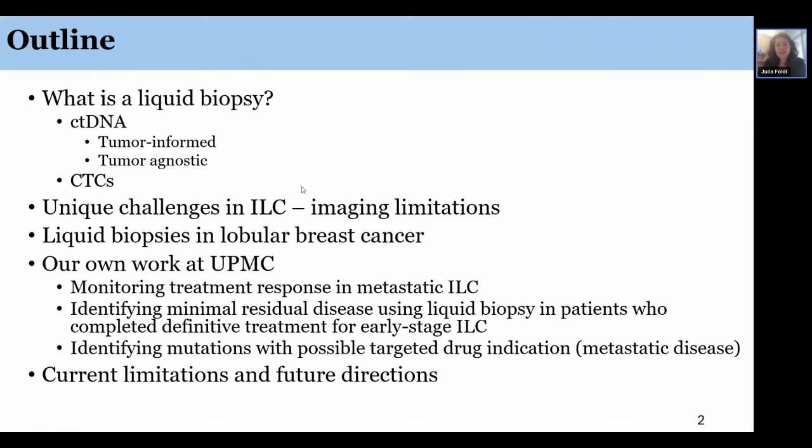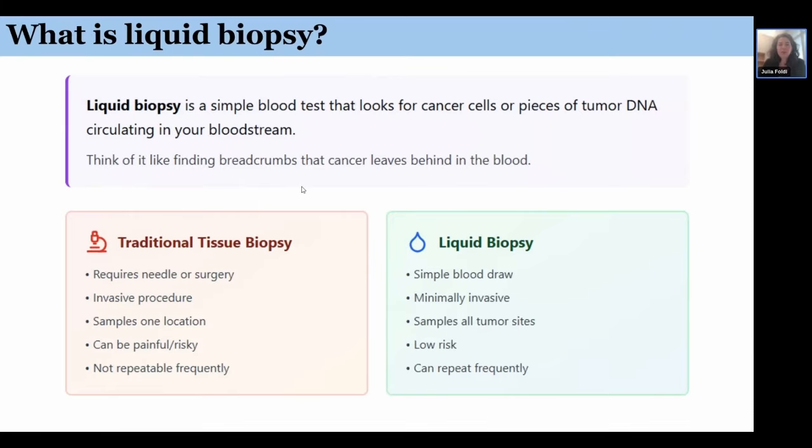And in the context of these studies, I'll talk a little bit about some real world scenarios where these assays that we'll be discussing can be used, and how they're currently used. And then, of course, there are some limitations to these assays, and so we'll talk about limitations and future directions towards the end.